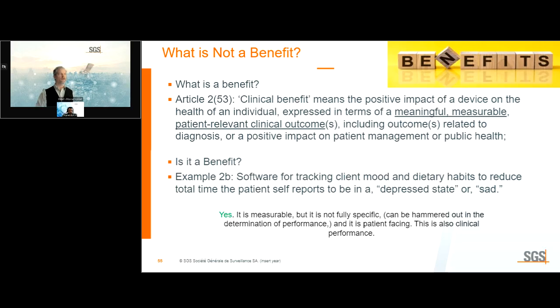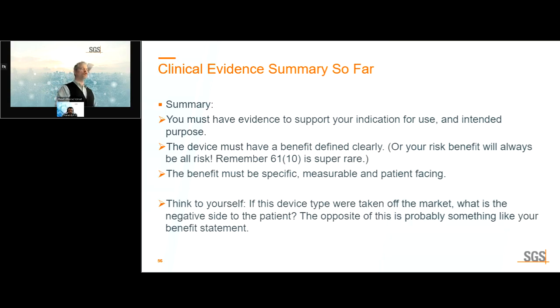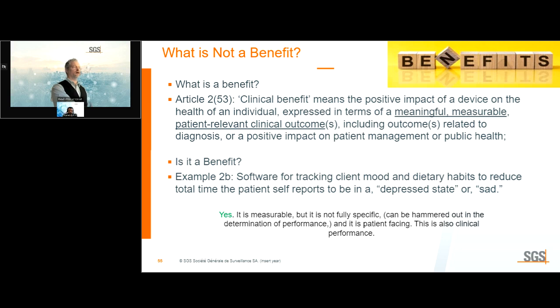Now this is starting to be into a clinical benefit. It's measurable. It's not fully specific, and we'll talk about that a little bit more. Why is it not fully specific? You're saying it reduced total time a patient spends in a reported depressed state. Against what? Compared to what? That's perfectly valid. You might have to hammer out the determined performance a little bit more, but I would consider this to be a benefit. Usually it would be something more in the vein, now that I think about it, oh, I did say reduce. Great. To reduce total time spent. So you're tracking it to help reduce a thing that is considered a deleterious effect.